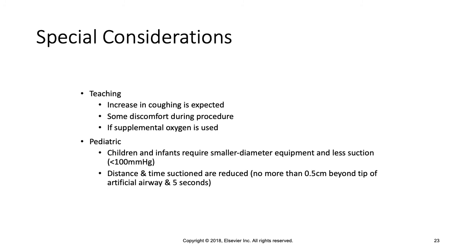Special considerations. Always teaching the patient will decrease apprehension in most cases. So let the patients know that they will have an increase in cough. We even encourage them to cough prior to suctioning. And remember, if you go down as far as the carina, they're going to cough. So let them know. You won't hear them coughing, but you can see their bodies moving as if they're coughing, because if they have a cuffed tube, you won't have the vocalizations. Let them know that they will have some discomfort, but it should not be painful.